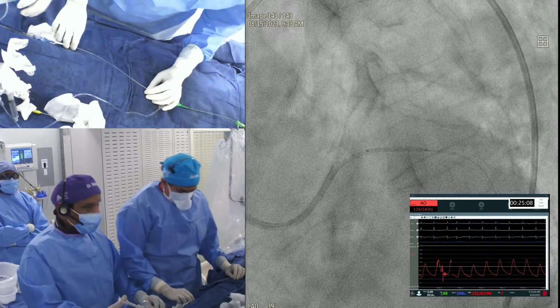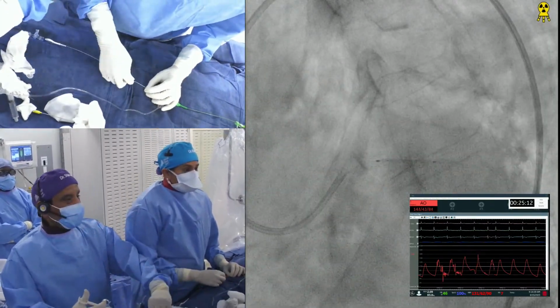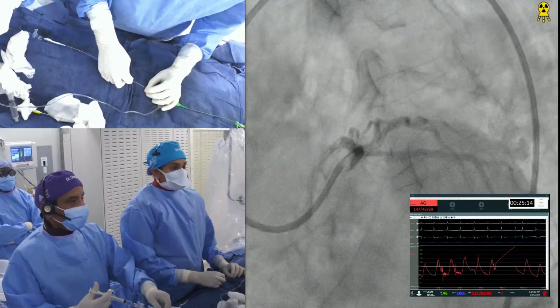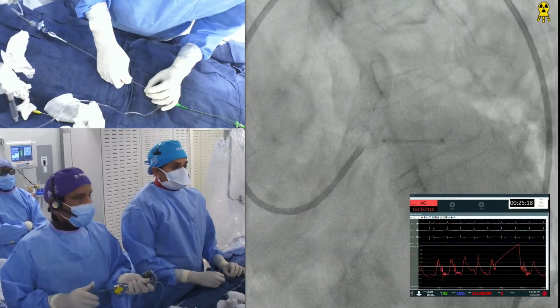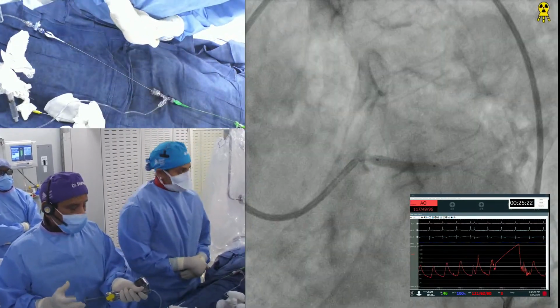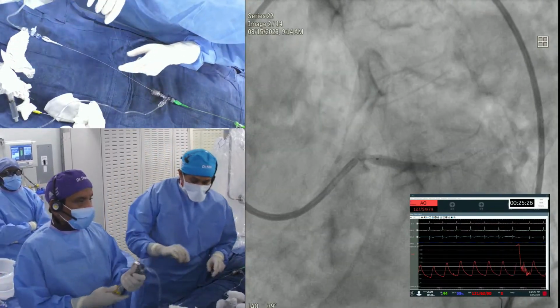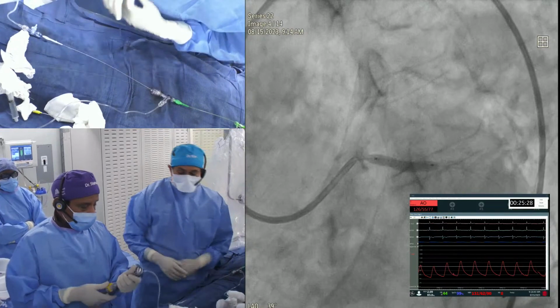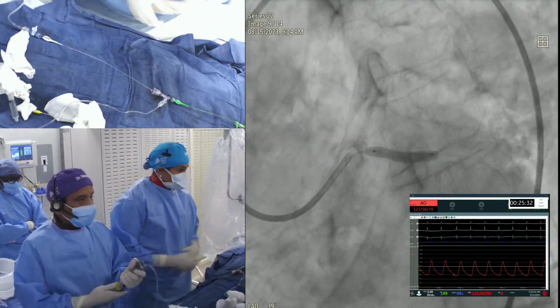Take this wire out. This is not prediction. You have to do the right things. Ready? Going up. But clearly we know the advantage of Synergy, flexibility. No, 16 atmospheres. No justice was done to Promus. You should have tried it again on the run-through. If it did not go, then you can say that.